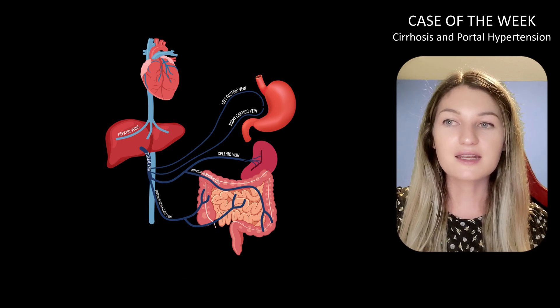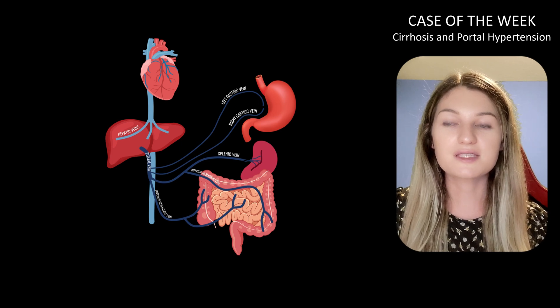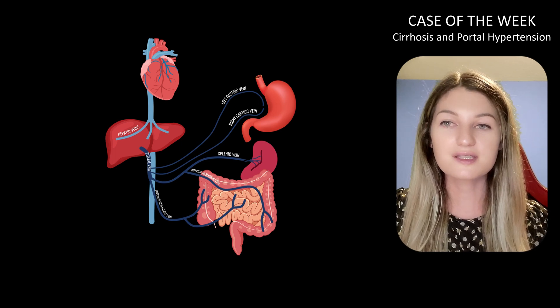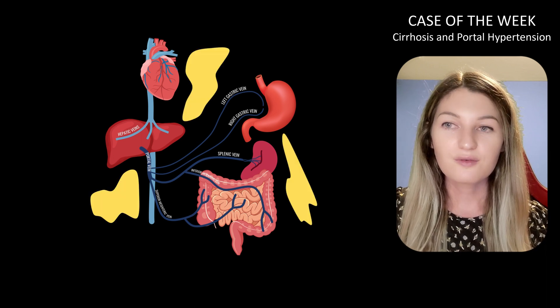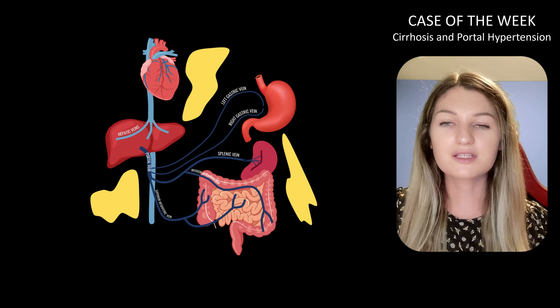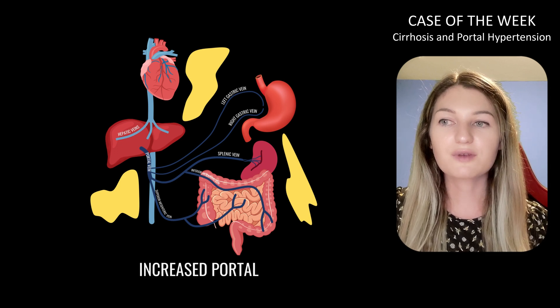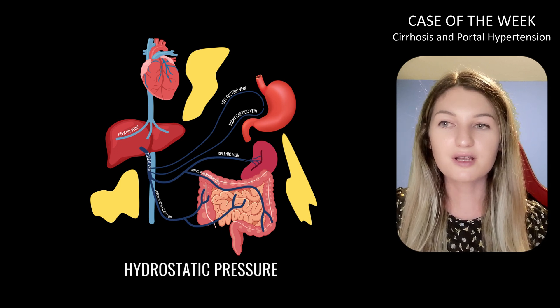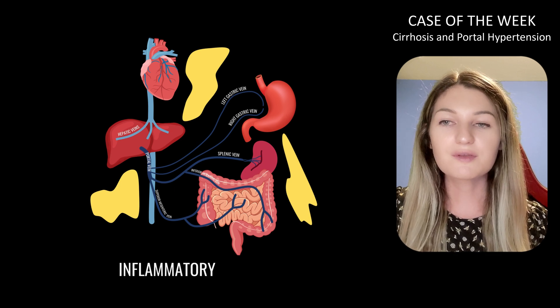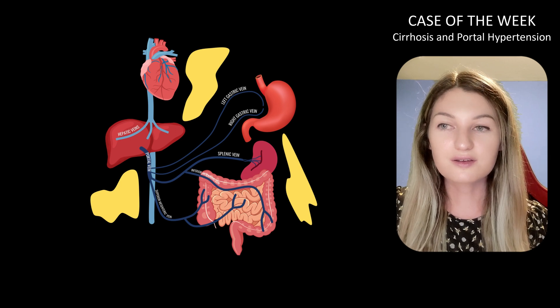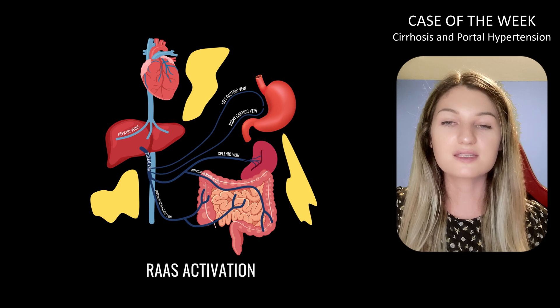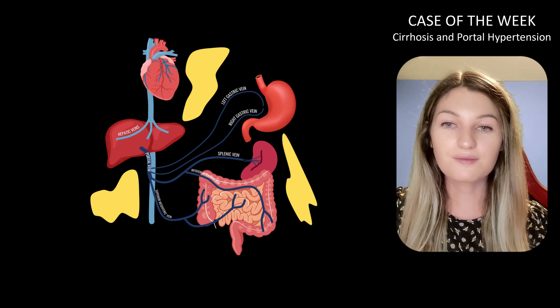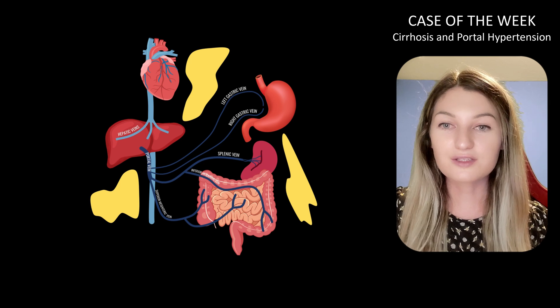Our patient did not have ascites, but this is another common manifestation of portal hypertension on CT, appearing as hypodense fluid in the peritoneal cavity. Elevated portal venous pressure causes a hydrostatic pressure imbalance and release of inflammatory mediators such as nitric oxide, leading to arterial dilatation and activation of the renin-angiotensin-aldosterone system, thus causing the body to retain more sodium and in turn more water.